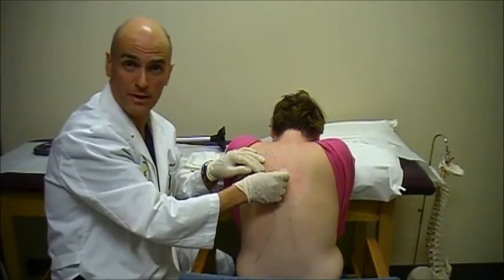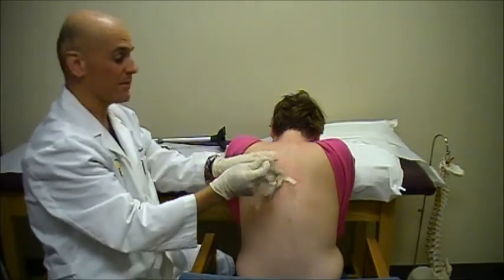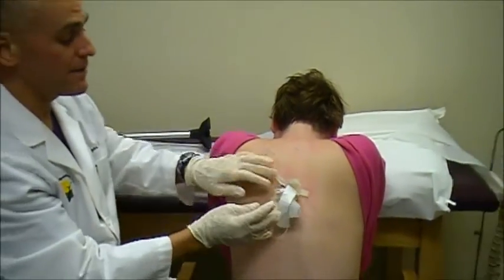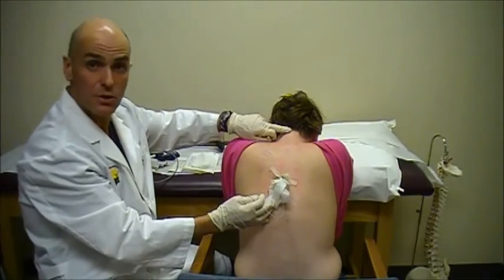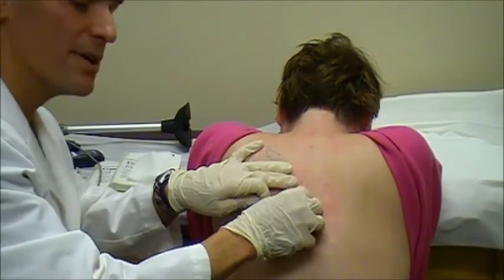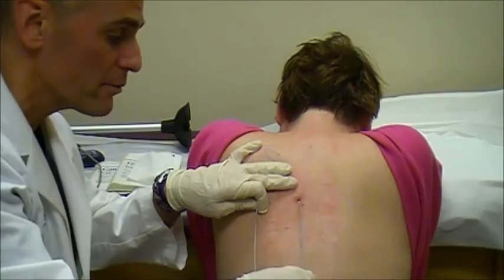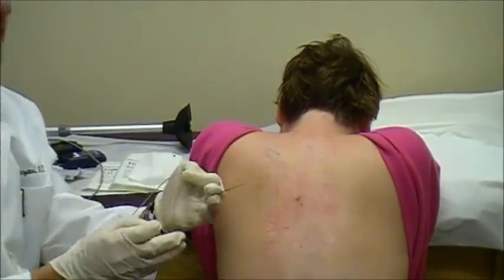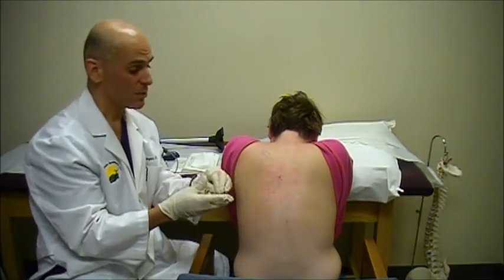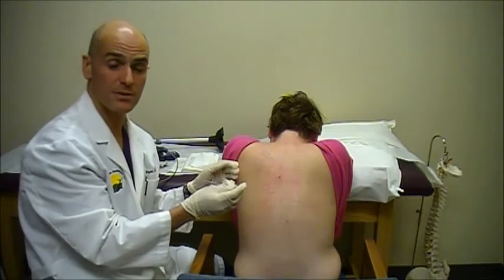We're now going to remove the spinal cord stimulator trial lead from Jen's neck and schedule her for a permanent implant. You can see this is the end of the lead that was connected to the extension cable the patient trialed at home, with the other end up at the C2 or C3 area. Jen, this is going to be a little bit of pressure. Deep breath now — pressure, pressure, pressure — and it's out. You can see the lead with all eight contacts and the tips intact. We'll put a band-aid on here, the patient can go home, and we'll schedule the permanent implant.